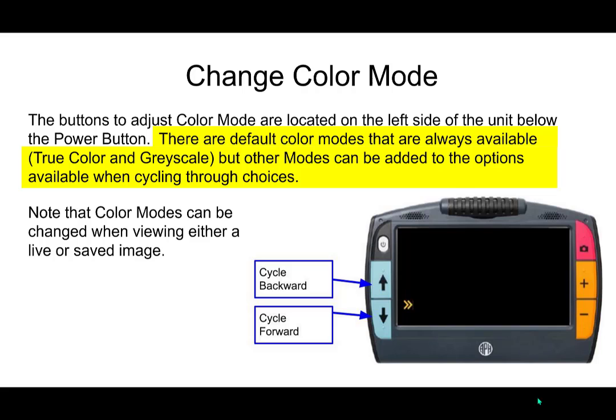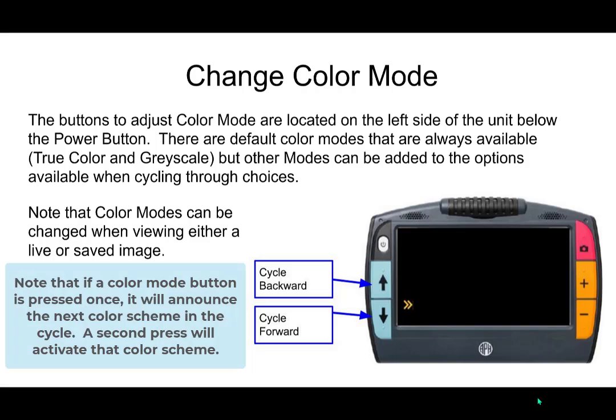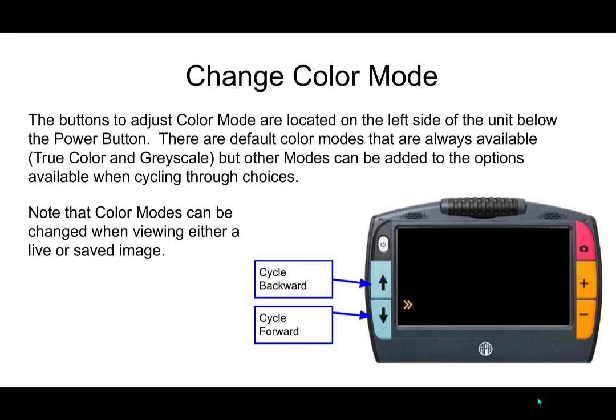What will happen is if you press the up button or down button, it cycles through those options. If you press that button, it'll tell you what the next color scheme is when the menus are talking. And then if you press it again, that color scheme is activated. So again, you would need to double press that button to move between those colors. And again, these also work in both live and save modes.